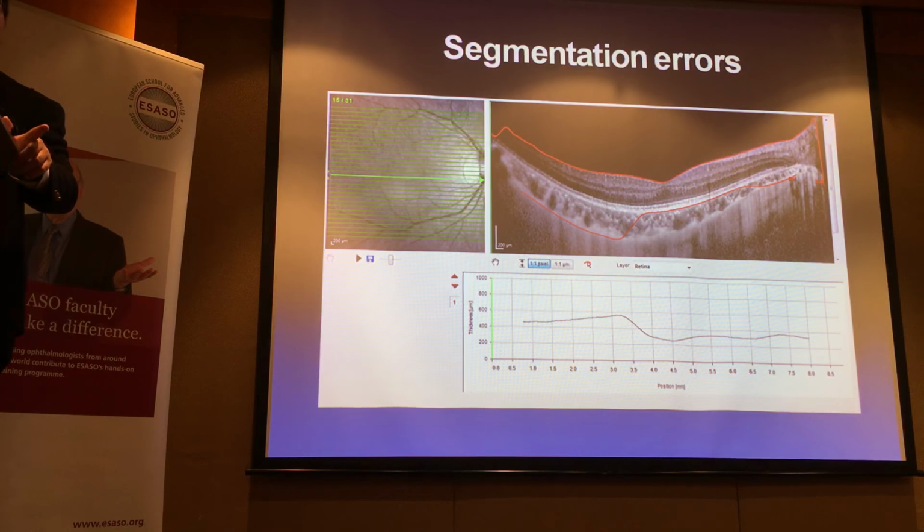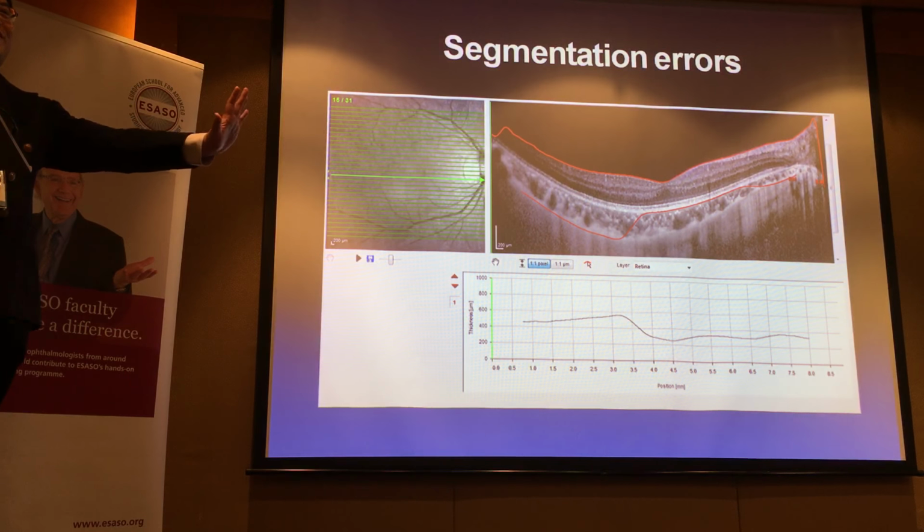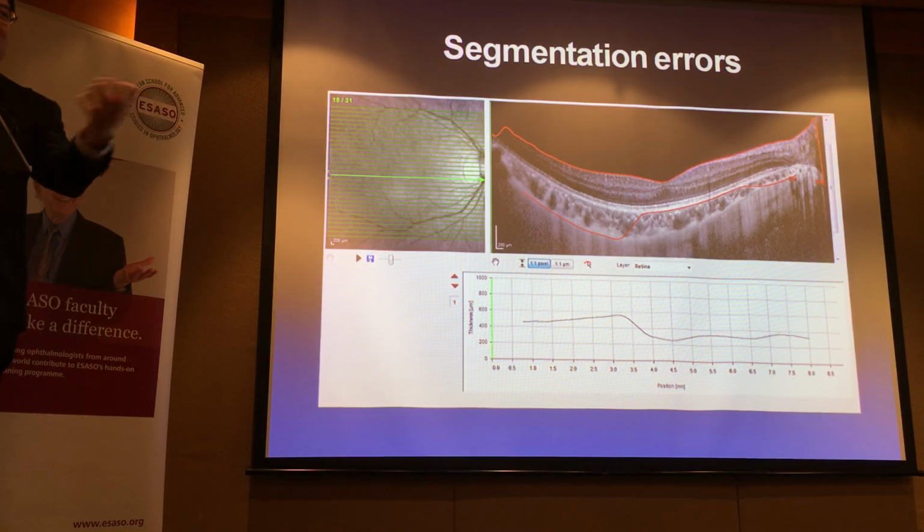Sure. Good point. Not entirely related to this, but sometimes if you're performing a scan yourself, if you have a difficult patient, either an uncooperative patient or limitations where you have to use a lens, the moment you get an image, it's like taking a photo, right? If you're trying to take a fast-moving object, you won't have time to focus, compared to a person who's posing for you. So if you get a chance, just snap a photo. It's like a digital camera. You can just delete the useless ones later. So sometimes you need to compromise and just get the best possible image.